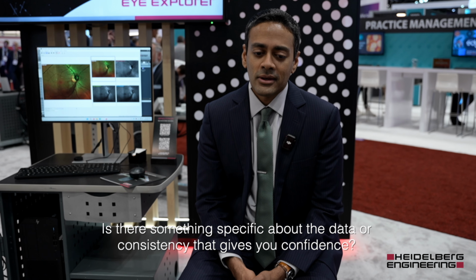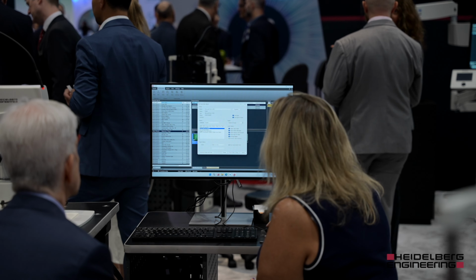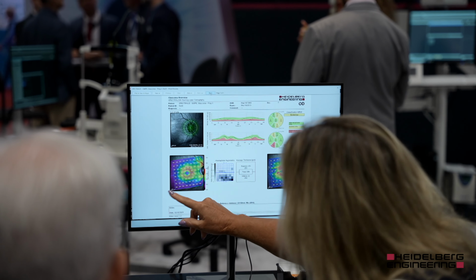And the GMPE is a really useful piece of software because it not only allows me to look at the optic nerve head, but it allows me to query the macula with a lot of detail. It allows me to evaluate for arcuate-like changes, which would be suspicious for progression in glaucoma using the macula scans.